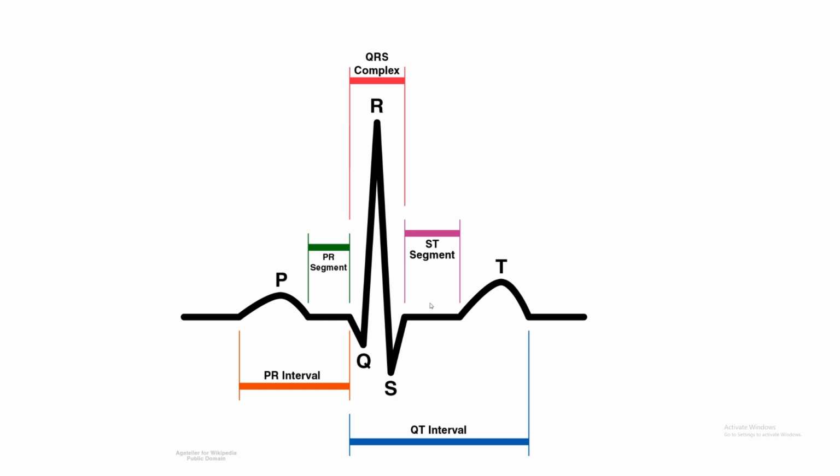This is your J point, right? If this ST segment is raised one little box, 1 millimeter above the isoelectric line, we've got a problem. That would be indicating a heart attack. There are other things that cause ST segment elevation, such as other cardiac abnormalities, such as ventricular hypertrophies. But in general, if you have ST segment elevation, it's typically not a great sign. Either someone has some sort of deeper underlying pathology, or if that's a new thing, it could potentially mean that they're having a myocardial infarction.